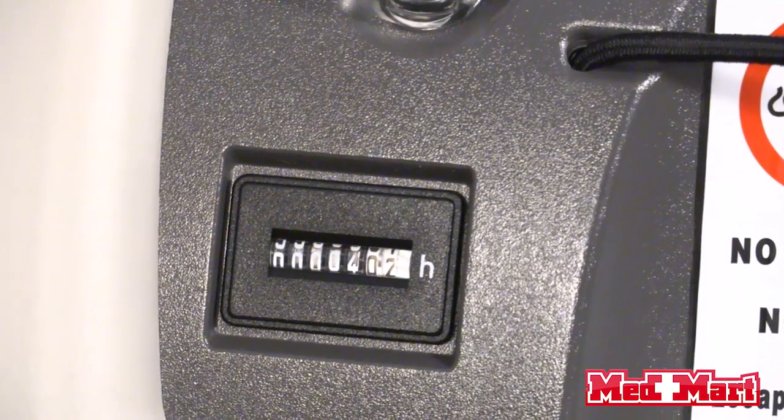On the left side of your machine is going to be your hours. You'll notice a few hours on the machine when it comes packaged to you — those are the test hours on the machine.